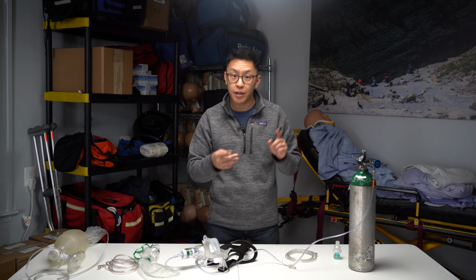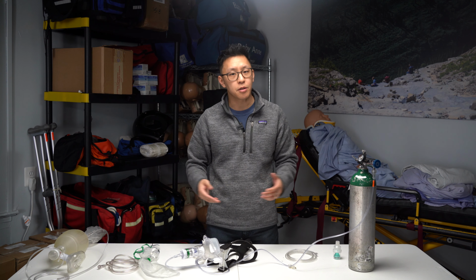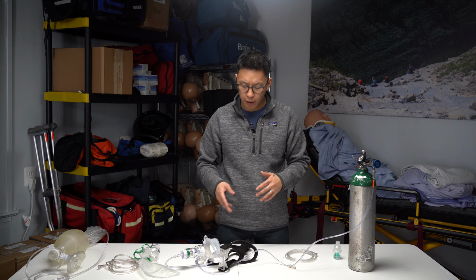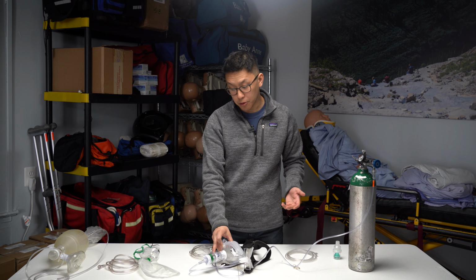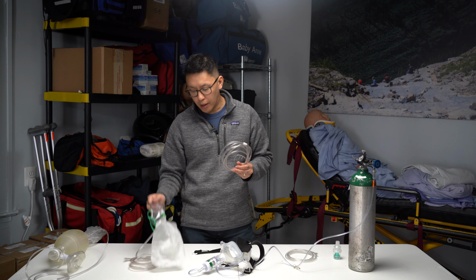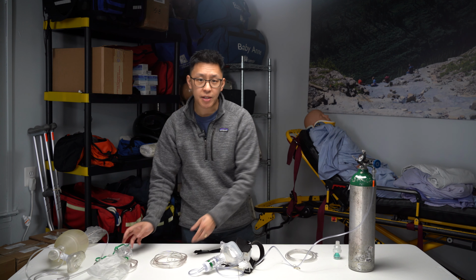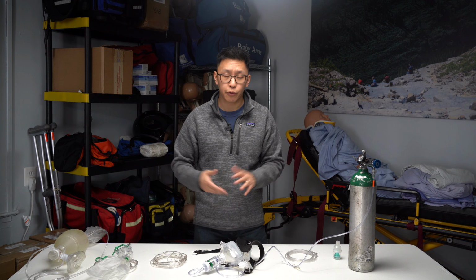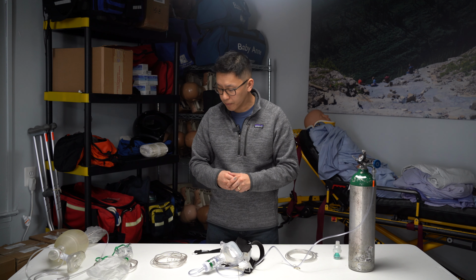And then there is a fourth indication related to a flail chest in trauma that you might see in certain protocols. And so Marty recently did a breakdown of when to use each device on the table, whether that's a nasal cannula, a non-rebreather, or a BVM, a nebkit. He has that breakdown, so I'll link it in the upper right-hand corner. This is solely for CPAP, which is short for continuous positive airway pressure, okay?